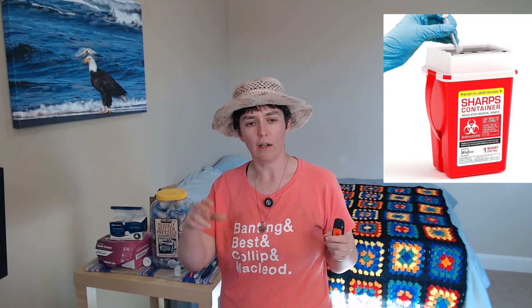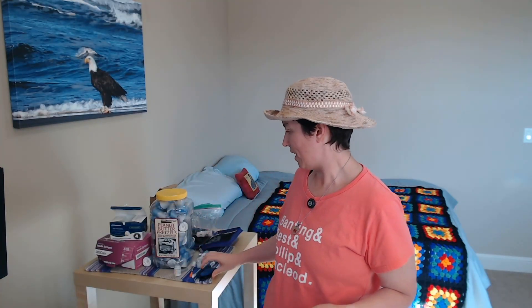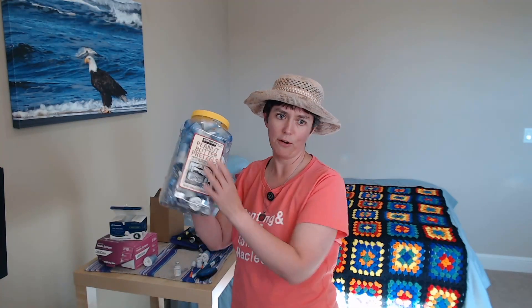That was a great discovery — I wish somebody had told me about that before. That's the easiest way of discarding needles if you are using insulin pens or insulin syringes. Otherwise, you could get a sharps container and put the whole insulin syringe into it. Or you can also use an empty plastic juice bottle or some plastic container that has a lid on it.